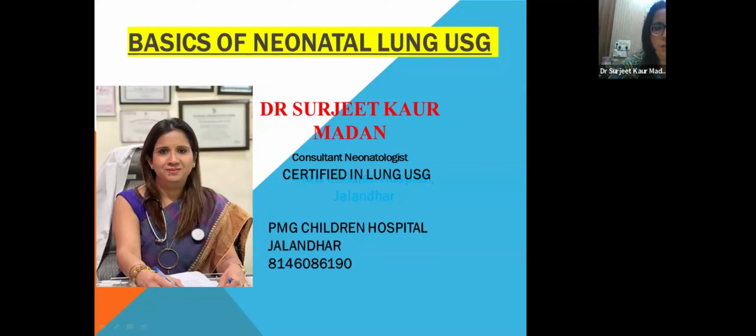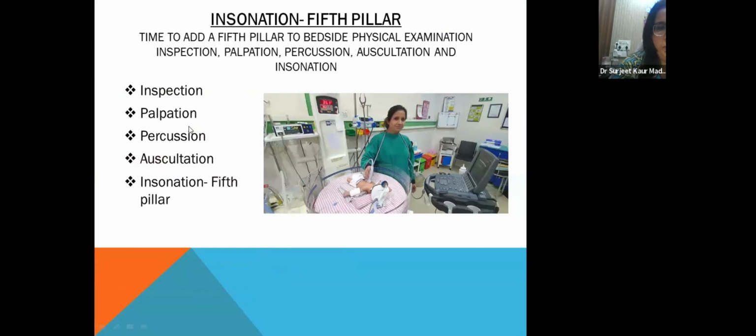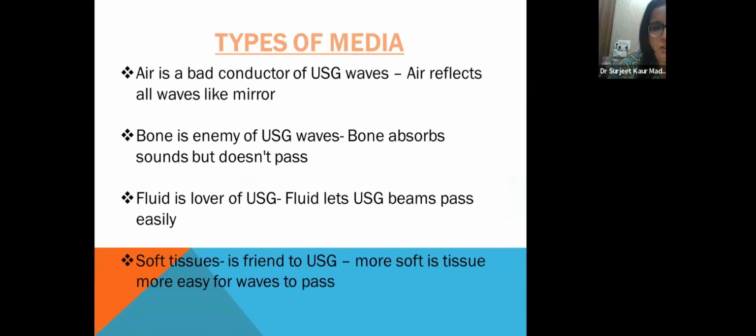Right, we're starting with the basics of neonatal lung ultrasound. Initially, during our bedside physical examination, we used to do inspection, palpation, percussion, auscultation, but now insonation has become the fifth pillar during our bedside physical examination. You all agree to this.